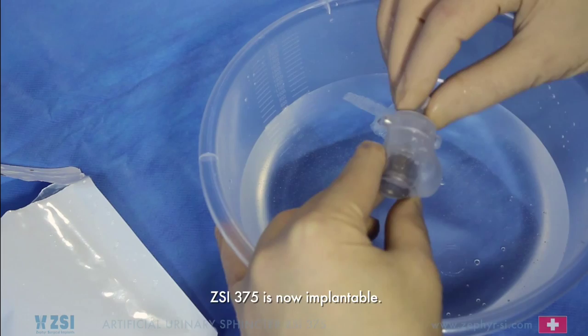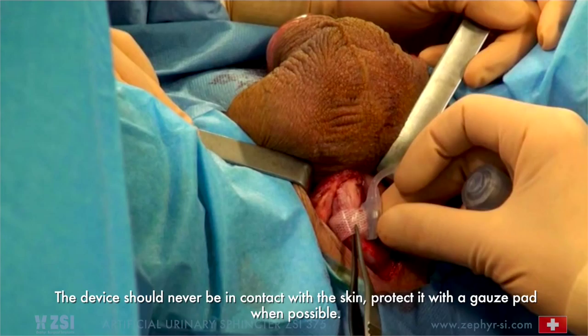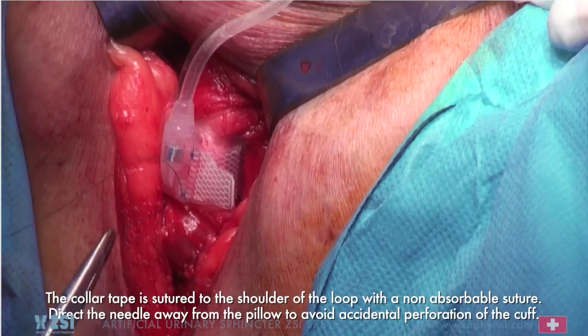Pull the collar tape through the loop. The pillow of the cuff must be in contact with the urethra. The device should never be in contact with the skin — protect it with a gauze pad when possible. The collar tape is sutured to the shoulder of the loop with a non-absorbable suture. Direct the needle away from the pillow to avoid accidental perforation of the cuff.